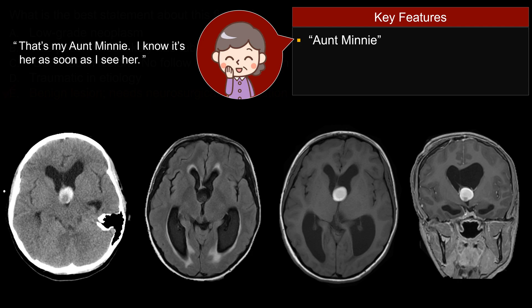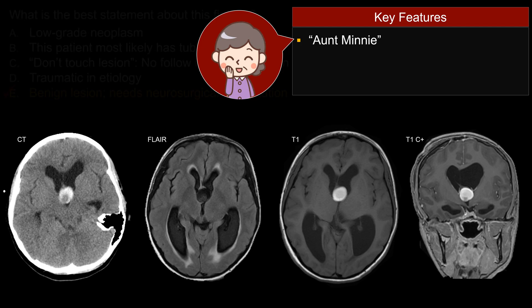It's like seeing your Aunt Minnie. When you see her, you know her right away. You recognize her. You don't have to think about it — you know that's your aunt. For this particular case, you can see this lesion is at the anterior or anterosuperior aspect of the third ventricle, next to the Foramen of Monro.